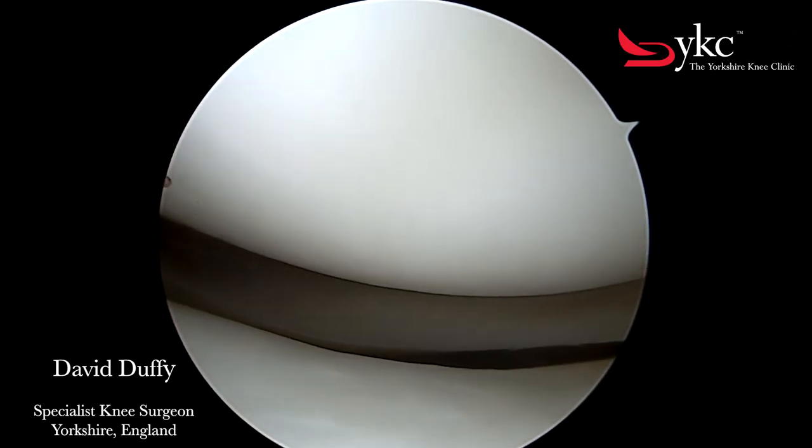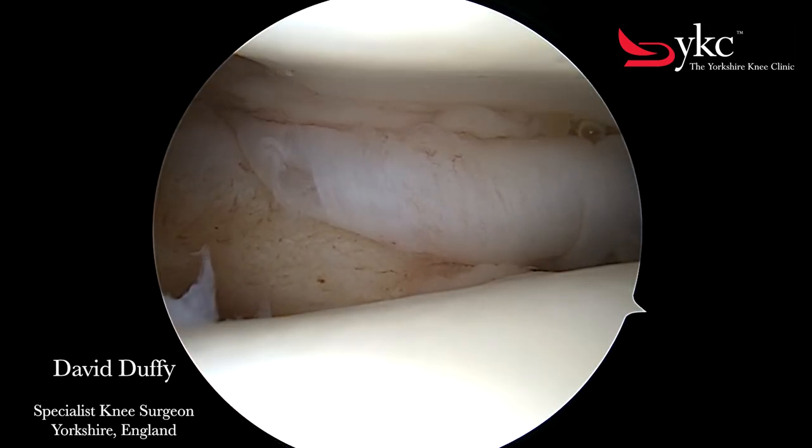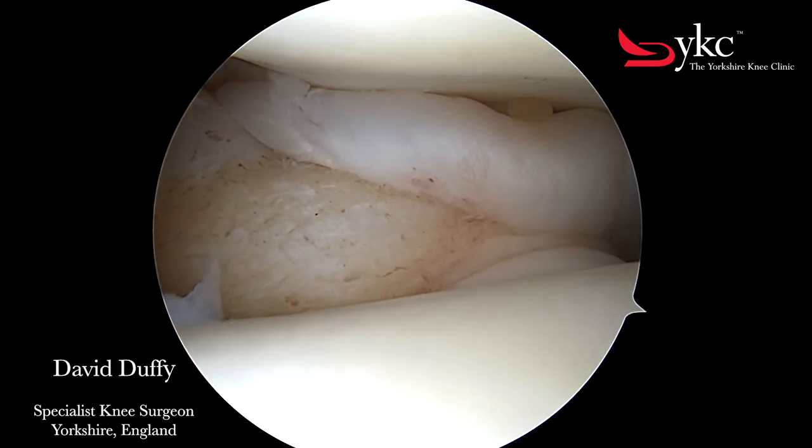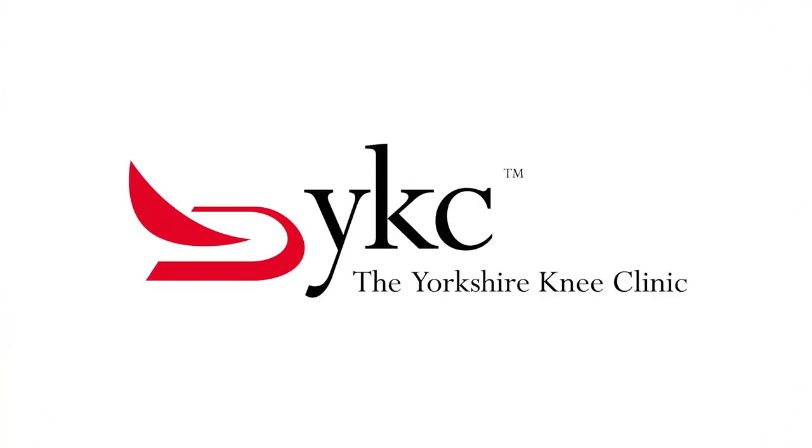At the end of the keyhole surgery the fluid is drained from the knee joint. As this happens, the lining can come rolling towards the camera like an underwater scene.